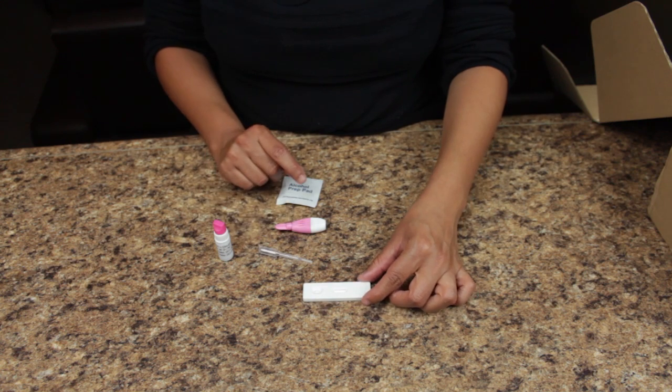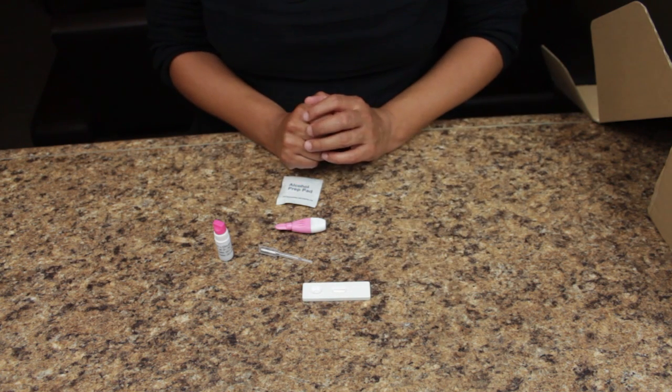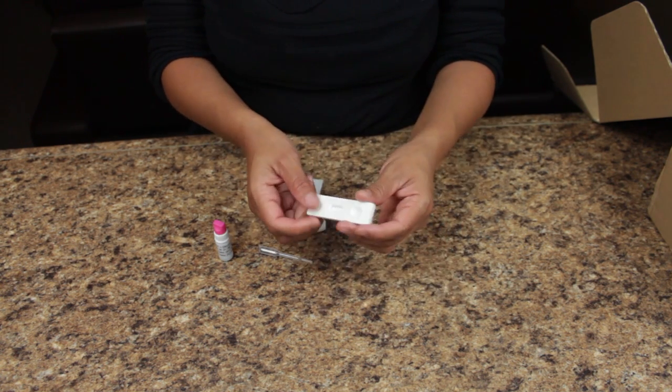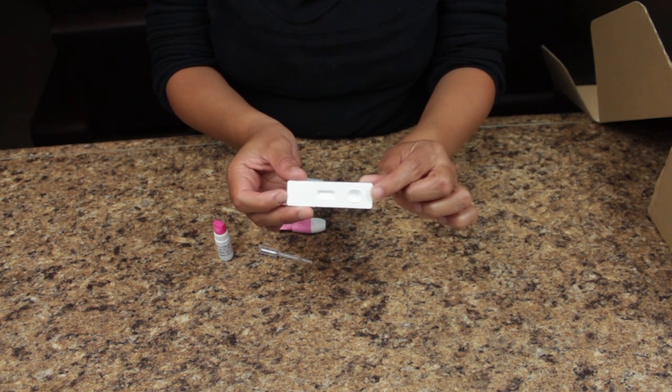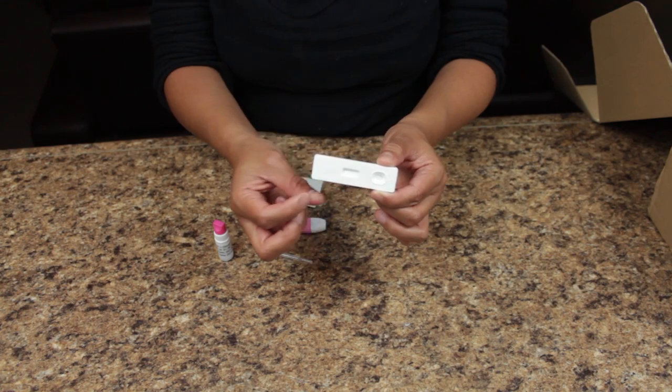Begin by placing the test cassette on a flat surface like so. The test cassette consists of two main parts: the well where you will place your blood sample, and the result window which will show the result.